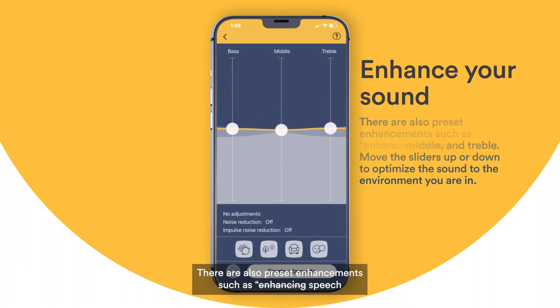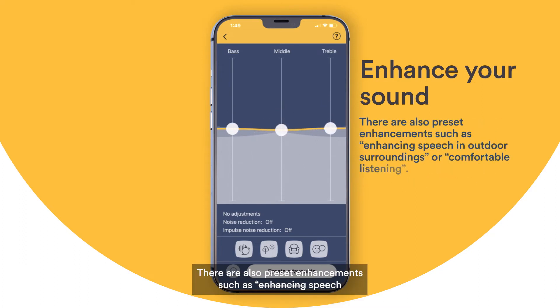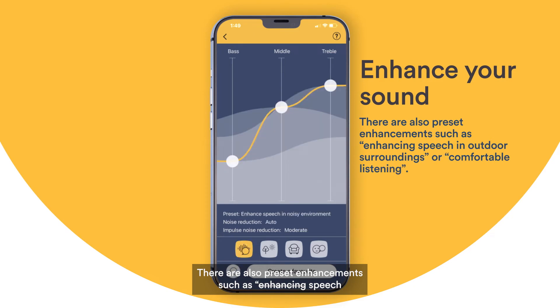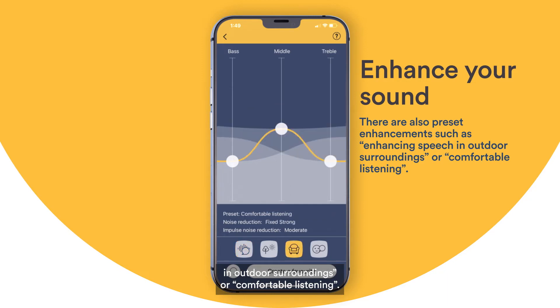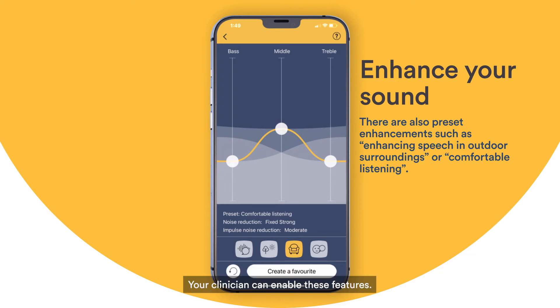There are also preset enhancements such as enhancing speech in outdoor surroundings or comfortable listening. Each symbol represents a different setting. Your clinician can enable these features.